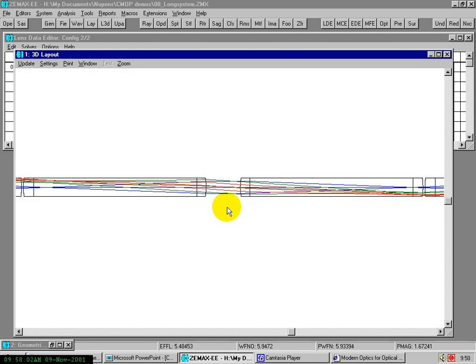What does it mean physically? That all the light that is present here will be forced into this aperture again. So the field lenses serve to maintain the amount of light in the system. Otherwise, a lot of light would be lost. Because imaging of the one aperture stop on the other aperture stop means the light that I have here must also be available here.